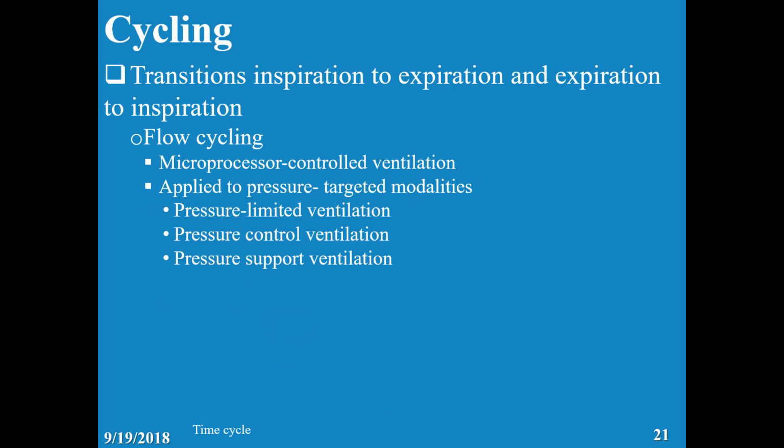We can use it in pressure limited ventilation. So we have volume control, but pressure limited. We will learn that in future. We can use it in pressure control ventilation, and we can use it in PSV.